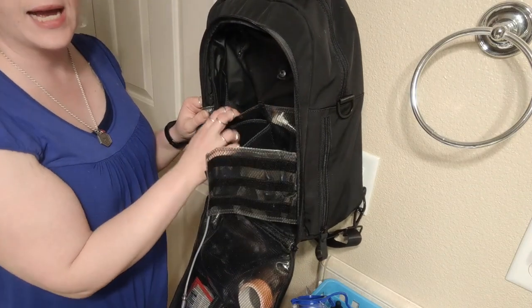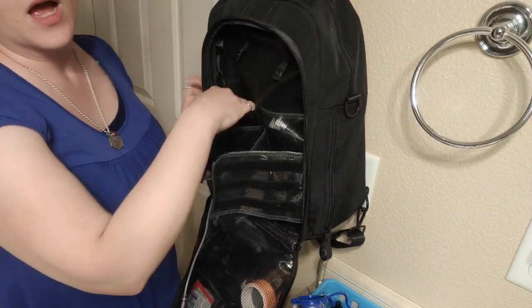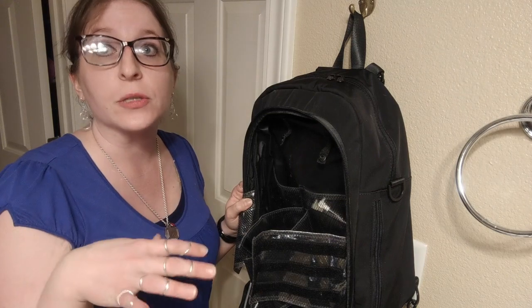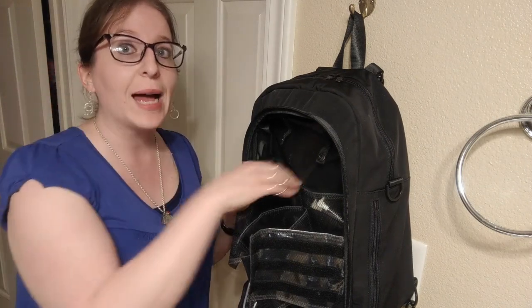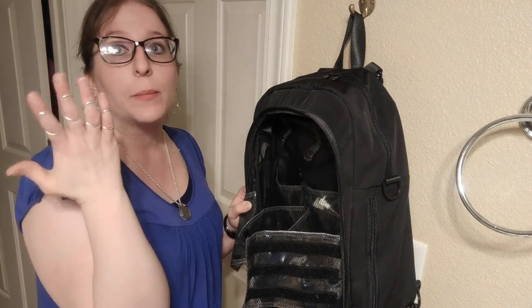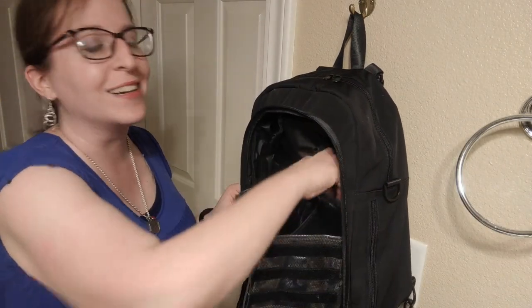And this actually has pockets. I know it's kind of hard to see clearly on black, but there's additional pockets back here. Some formulas and IV solutions and whatnot need to be refrigerated in certain temperatures, especially now that we're heading into summer. Not all of them do, but some do. You can take those reusable ice packs and slip one right back in here. It'll hold it in place right up against the bag the whole time. I have extra extensions stashed behind one of mine.